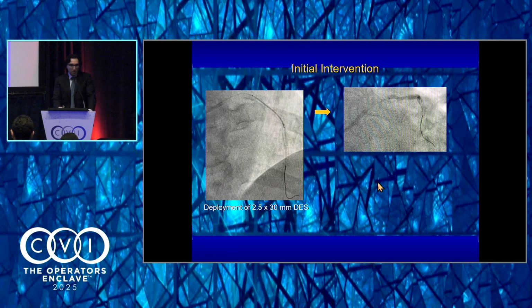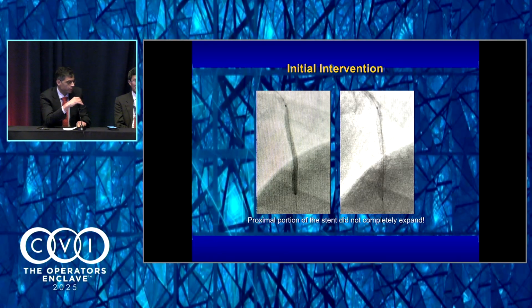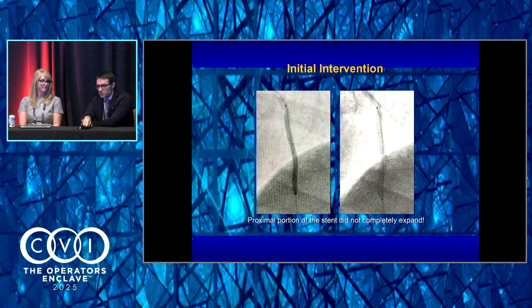Wait a minute here. So Max, you have tremendous experience, right? Would you have suspected this from the diagnostic angiogram, and what would you do at this point? Angiographically, less, but with intravascular ultrasound, sure. You can suspect angiographically there is an eccentric nodule at the proximal edge of the stent. That's my personal suspicion. So I perform imaging before we implant the stent. Similar intravascular imaging is necessary in such cases.